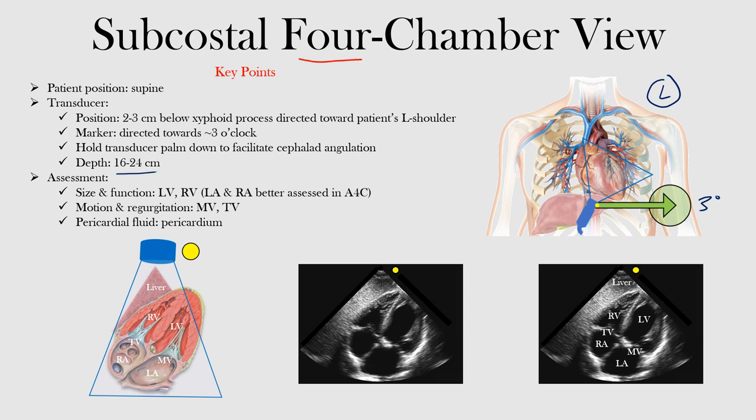You can adjust the depth — often between 16 and 24 centimeters should be sufficient, but you can adjust based on the patient. As the name implies, the subcostal view gives us four chambers: the right ventricle, which is the most anterior portion; the left ventricle; the right atrium; and the left atrium. We saw the mitral valve and the tricuspid valve between the atria and ventricles. The liver sits in the anterior portion, visible at the top of the image. This view is great for assessing size and function of the ventricles, valve motion and regurgitation, and any evidence of pericardial effusion.